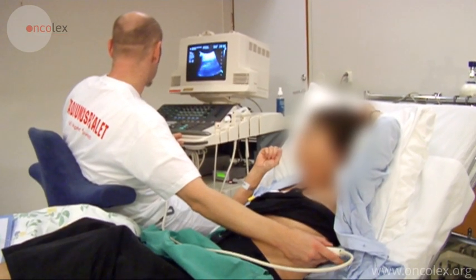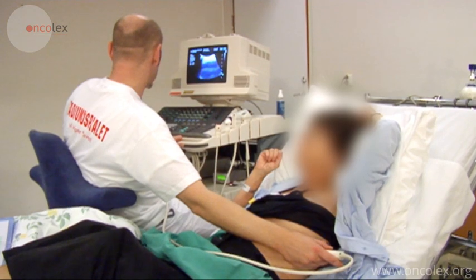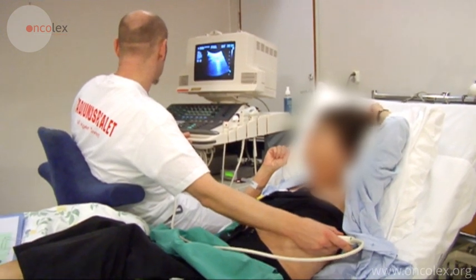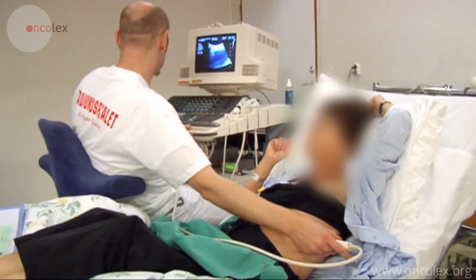This is a video of a pleural tap, the removal of fluid from the pleural space.